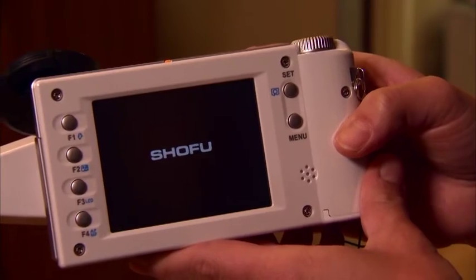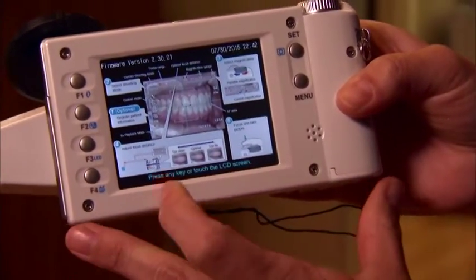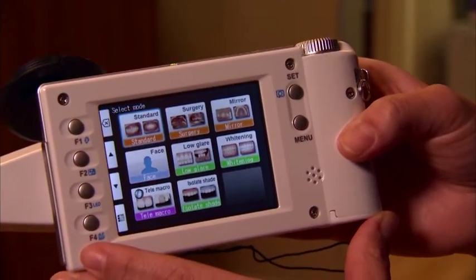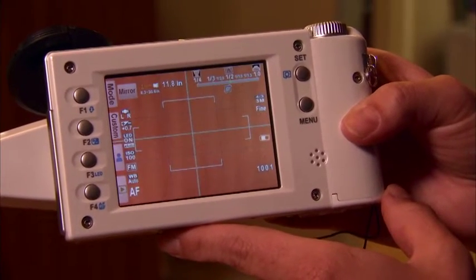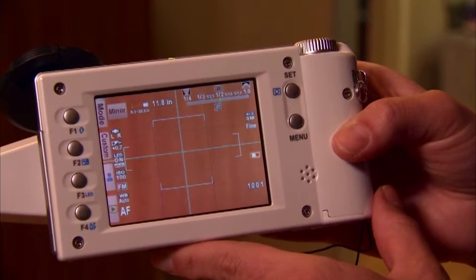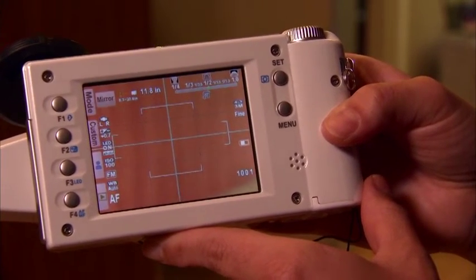For the occlusal shot, we're going to turn on the camera, touch the touchscreen, and then go to mode. This time you're going to choose mirror mode. When you hit mirror mode, it is basically going to be set up and ready to go. Notice you're going to be around 12 inches away to be able to expose a good shot.